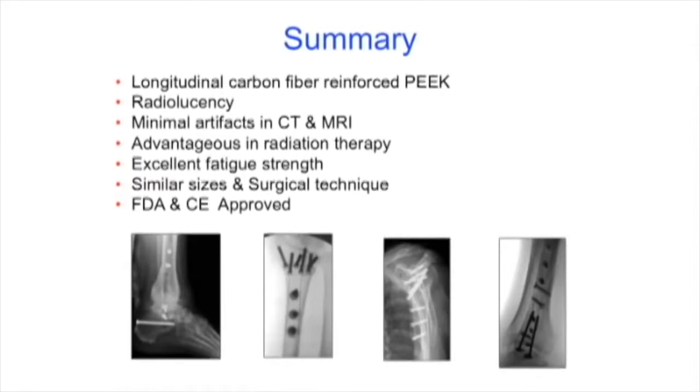And in fact, at times, it could actually be a little bit cheaper because the amount of stuff that they use is pretty much no frills. It's very basic and it's very slimmed down to only what you need. And so the amount of trays that they need are much less than your standard, let's say gamma nail or TFN set, which comes in multiple trays. They're slimmed down a lot more. And so their implant processing and overall costs are about comparable to what you're seeing right now. So it's not like, for example, you're paying three or four times out from what you're normally paying.